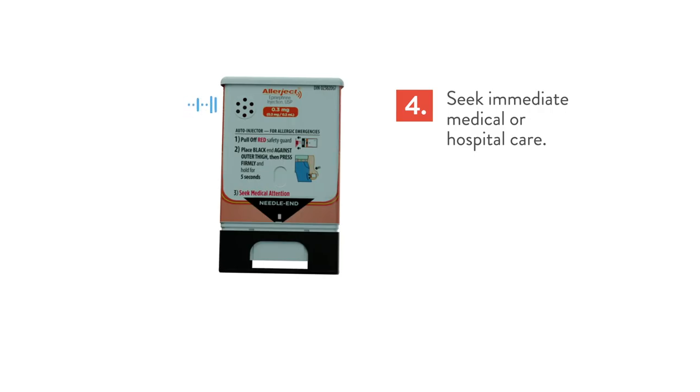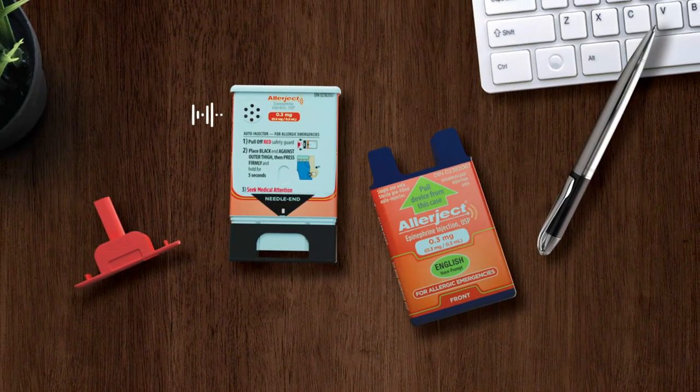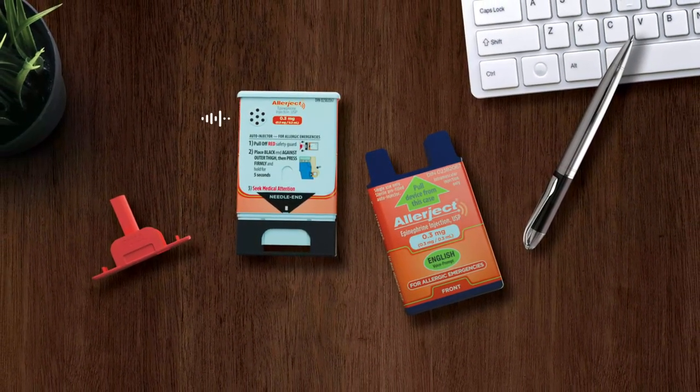Seek emergency medical attention. This device has been used and should be taken to your pharmacist or physician for proper disposal and replacement.